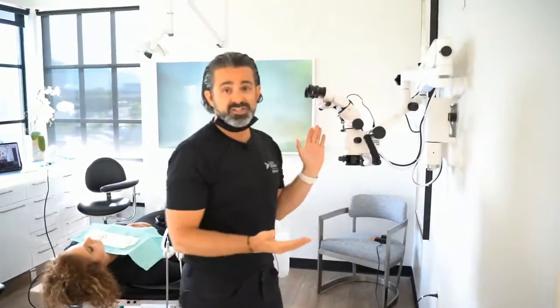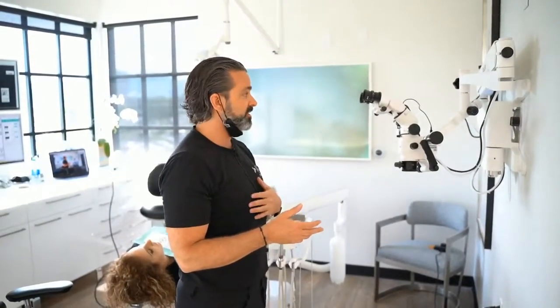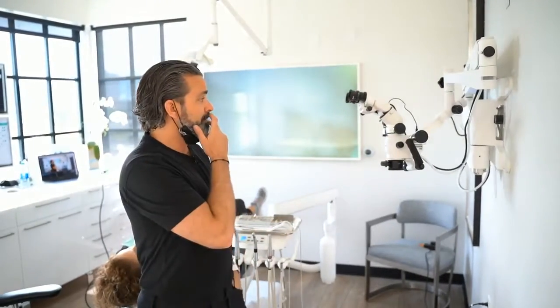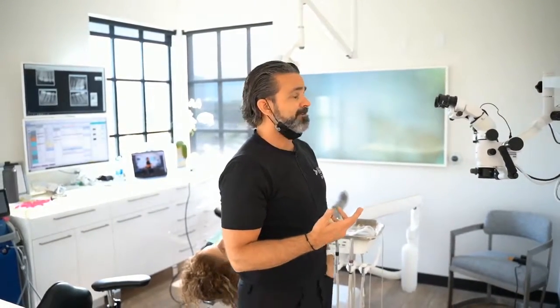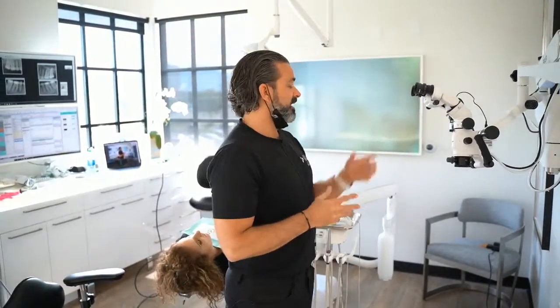If you're not going to change how you are, and you are interested in a neck correction, then if you're a forward leaner, you don't want this length. Go shorter. I always get commented on the way that I sit. People always comment on my posture, and it's really because I've learned to sit upright with that microscope.